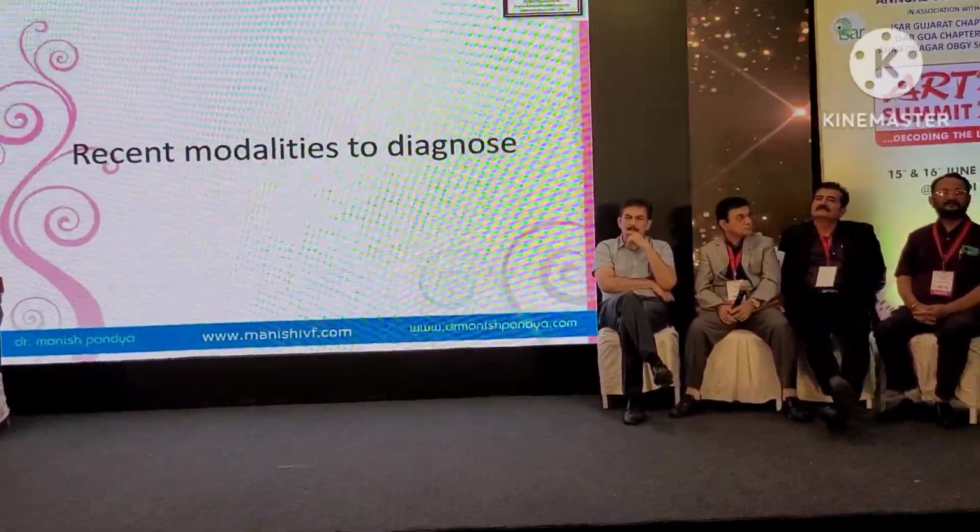And second thing, all the clots and debris are not very good reflectors of ultrasound, so both look black because they don't reflect the ultrasound. The things which don't reflect look black on ultrasound. But here you should differentiate between too much black and a little bit less black. If you have any doubts, go for 3D. It will be still better. And a hemorrhagic cyst may have a thin septa inside. Yes, so that is a honeycomb appearance, you can say. And the chocolate cyst is a clear ground glass appearance. And always correlate with the symptoms of the patient.